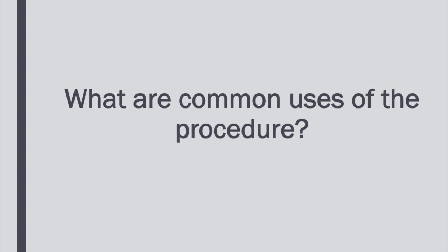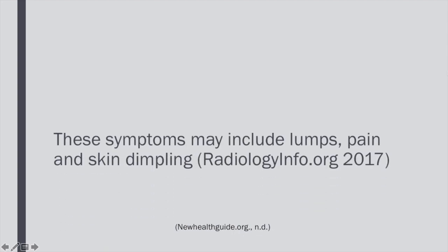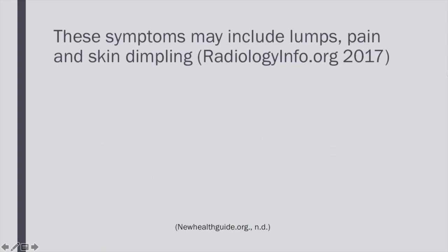What are common uses of the procedure? Mammograms are used to detect early breast cancer in women experiencing no symptoms, and also to detect the diagnosed breast disease in women experiencing symptoms. These symptoms may include lumps, pain, and skin dimpling.